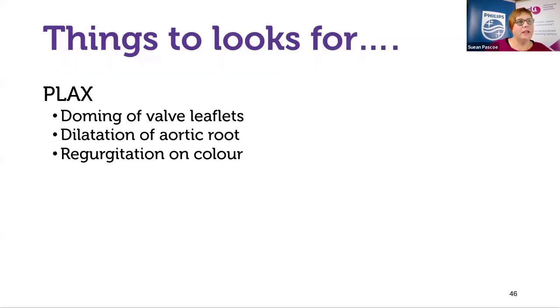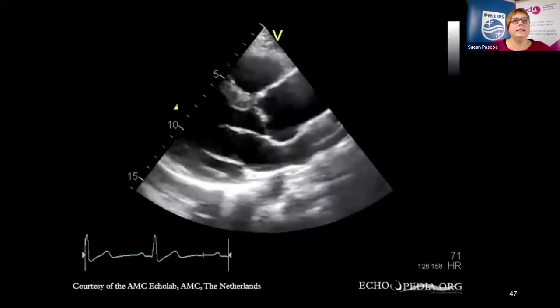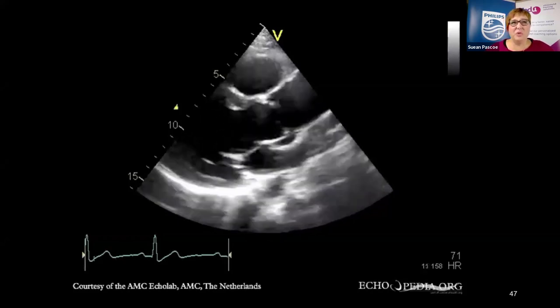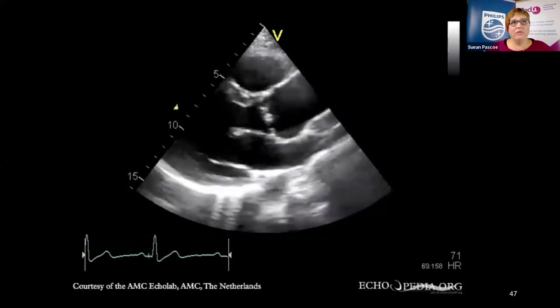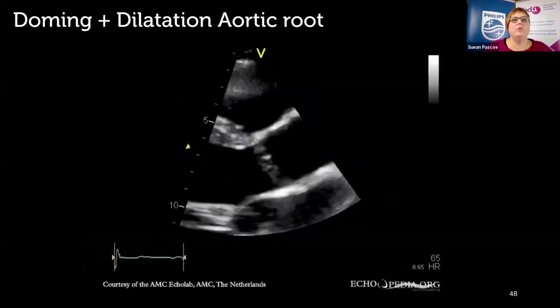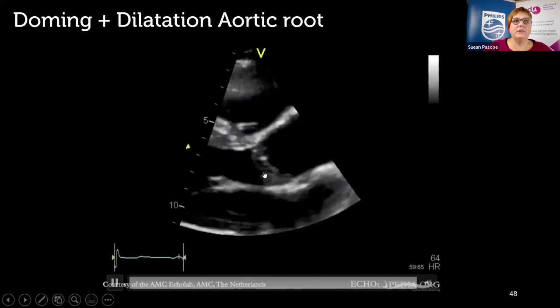In the parasternal long-axis view, look for doming of the valve leaflets, which often comes with dilatation of the aortic root. With color Doppler you'll see regurgitation. The normal view is the Mercedes sign — if it doesn't look like a Mercedes sign, something is going on. Here's an example of a bicuspid valve in long axis — to me it looks reasonably normal, maybe the aortic root is a bit dilated, those valve leaflets are a little thickened and not as clean as normal, but nothing screams out definitively as bicuspid. Here's a more obvious example with dilatation of the aortic root and doming of the valve leaflets.